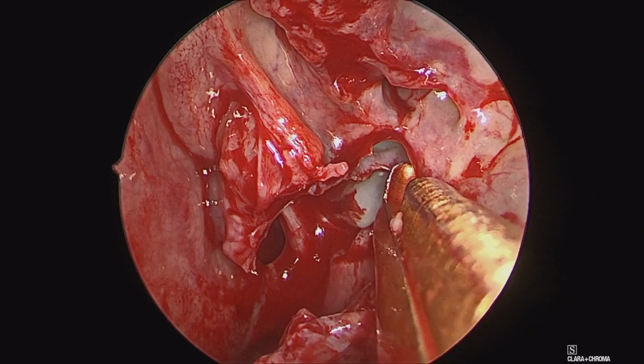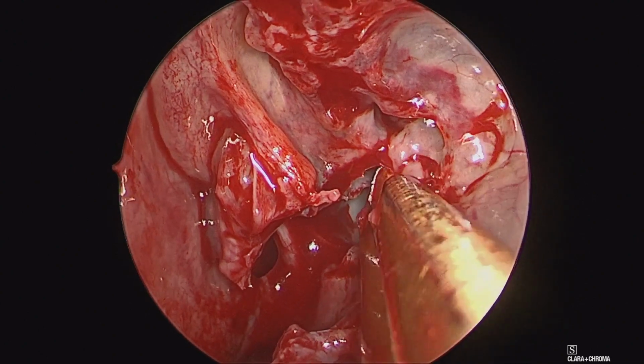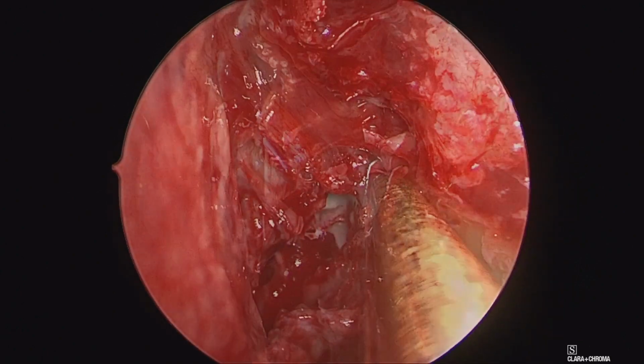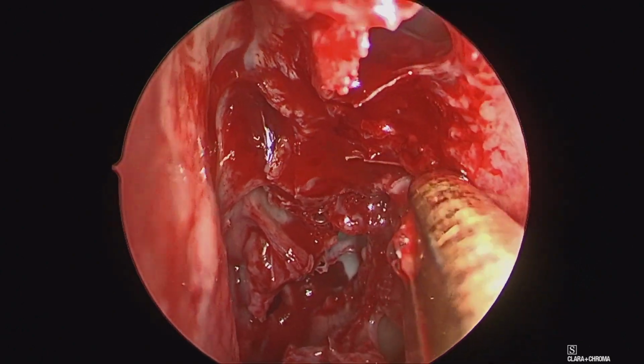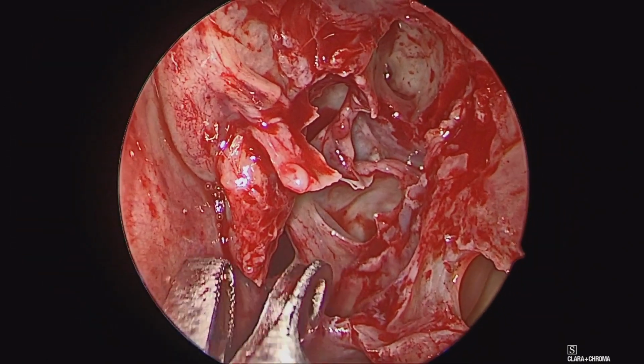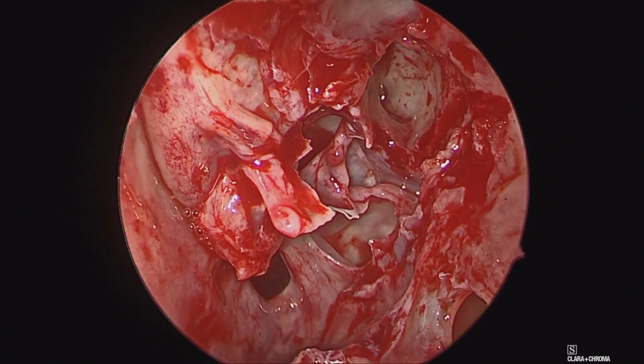We are then improving our access here laterally, further dissecting out and skeletonizing the orbit and working up higher towards the ethmoid skull base here as well, as we increase our access to the last bit of the tumor dissection. This is the last bit of the remaining tumor, as you can see here, nearing its bony partition attachment along the skull base.